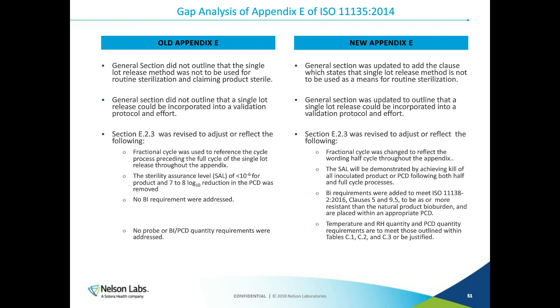So the general section was updated to add the clause which states that the single lot release method is not to be used as a means for routine sterilization. The general section was also updated to outline that the single lot release could be incorporated into a validation protocol or into a validation effort.